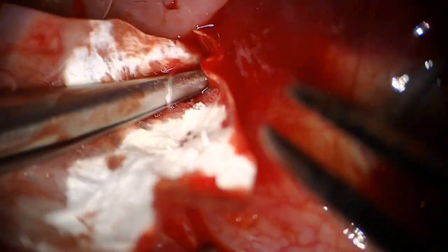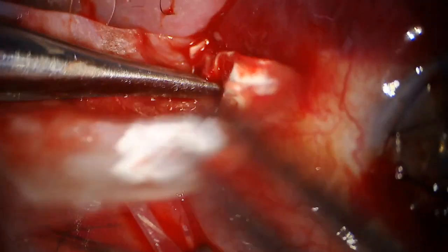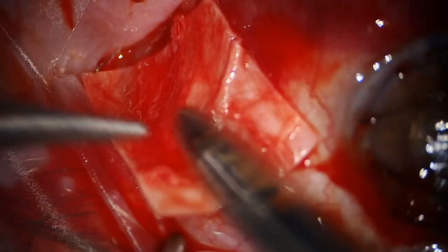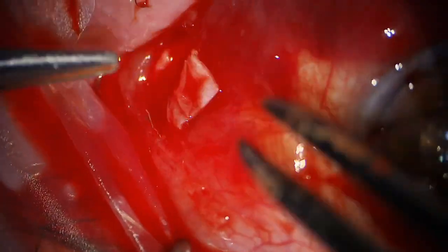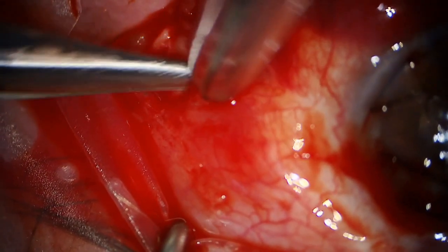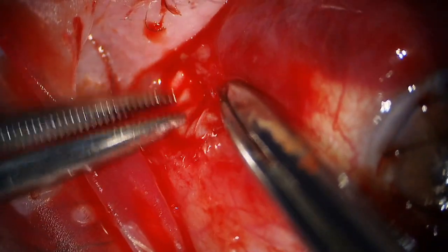Try and stick a bit of pericardium through the hole. I usually try and get the biggest piece in I can. This was too big, so this was not going to happen. So then I took it back out again and cut a large piece off. Again, stuffed it through the hole. And there still wasn't any chance of closing the conj here, even though it's a relatively small hole. It's just very tight. So I took a conjunctival autograft from inferiorly, which you'll see in a sec.